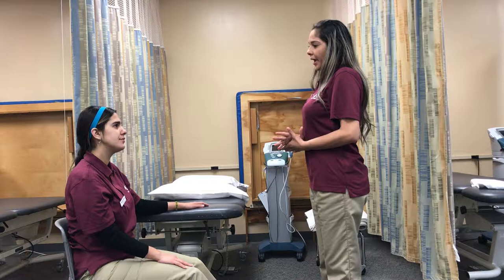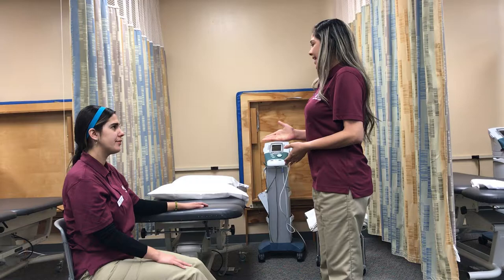Okay, the treatment will help you decrease your pain, decrease the muscle spasms in the area, and increase your mobility, okay? Okay. So, perfect. Let's start the treatment.